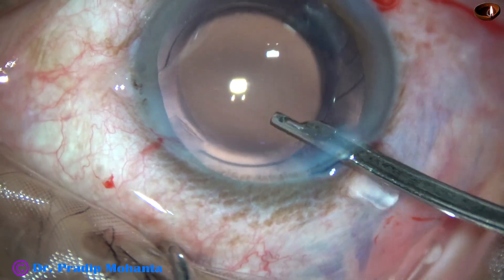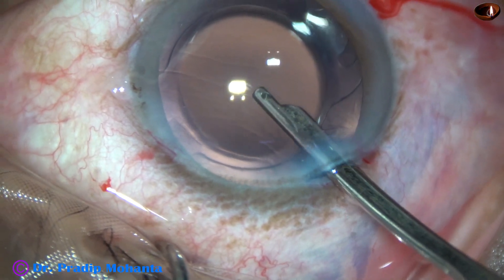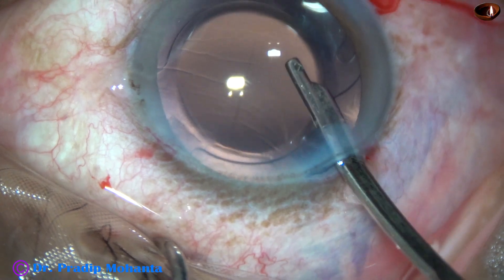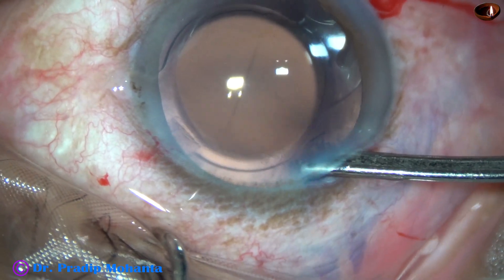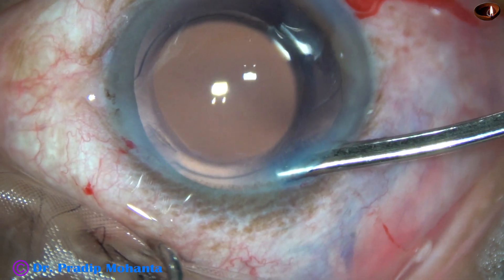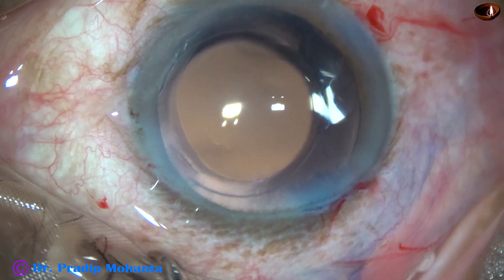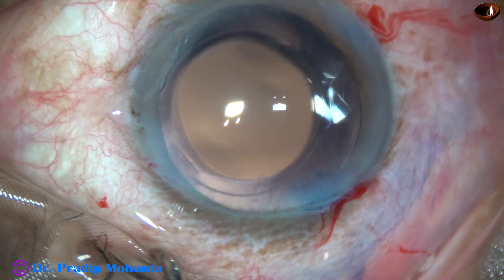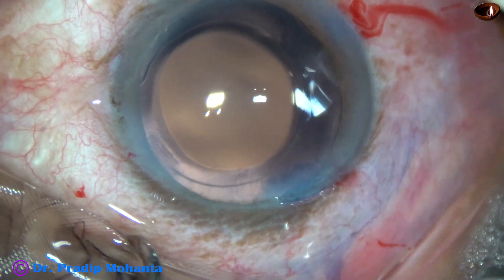We can see that the optic of the intraocular lens is covered by the anterior capsular rim all around, so the size of the rhexis is ideal — about 5.5 or 5.25 mm. The anterior chamber is formed nicely, and then the integrity of the wounds is checked with a cotton-tipped applicator.